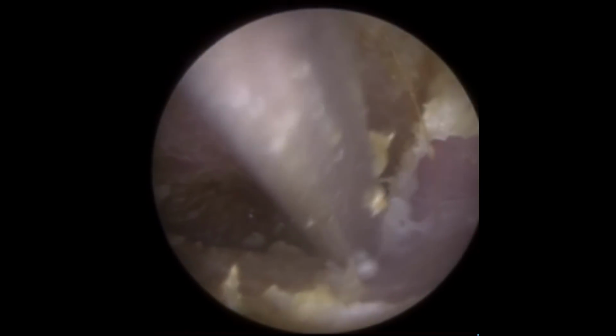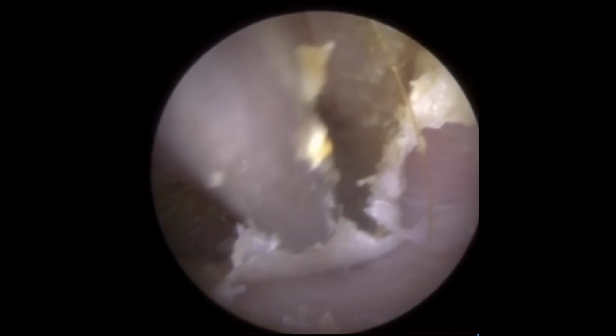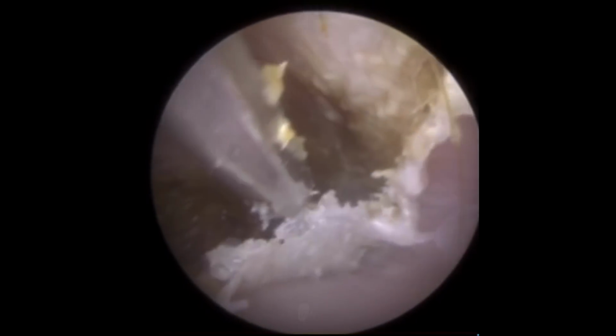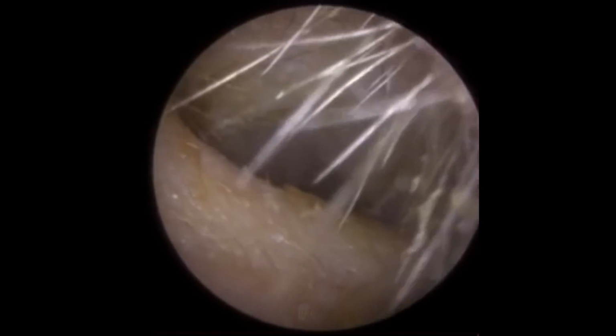And of course we have to be very gentle because we are peeling skin directly off the ear canal. The outer third of the ear canal is semi-flexible and therefore semi-sensitive. It's made up of cartilage and some muscles and fatty tissue. So if you do come in contact with the outer third of the ear canal, although the patient can feel it, it's not going to be excruciatingly painful for them. However, the inner two thirds of the ear canal is a very thin layer of skin, approximately 0.1 millimeters in thickness, and that's directly coating the bony part of the ear canal. So if you do make contact with the bony part of the ear canal, believe you me, it's very uncomfortable and very sensitive for the patient.